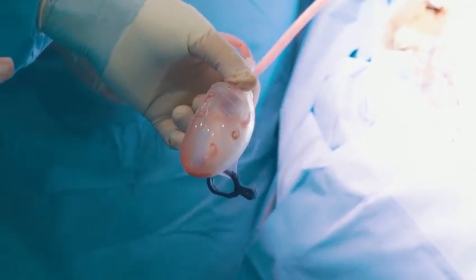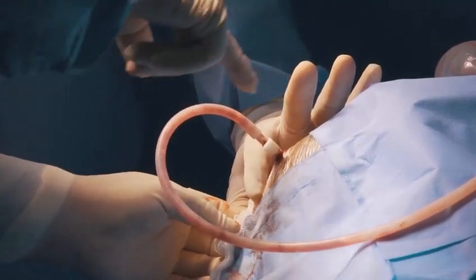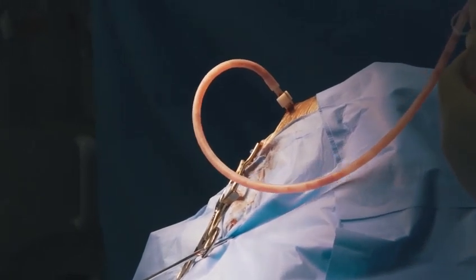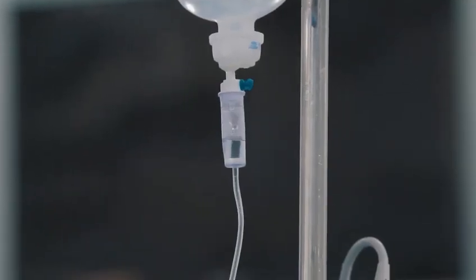Following insertion of the NASP, especially if the subdural hematoma has a large acute component, the surgeon could inject through the needle access port 500 units of heparin sodium, USP porcine, preservative-free, 0.5 cc, into the NASP lumen and tube to prevent intraluminal coagulation of the blood and plugging of the system.